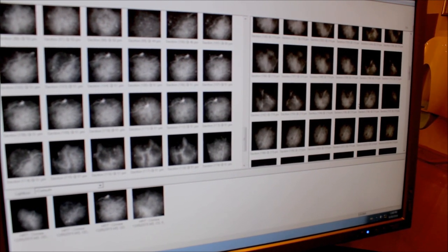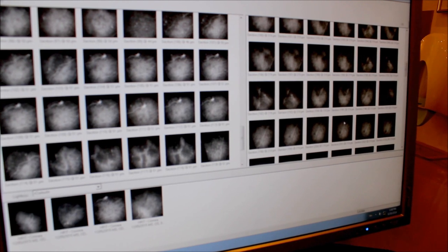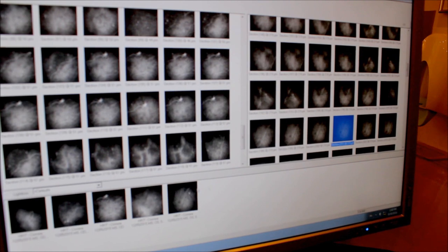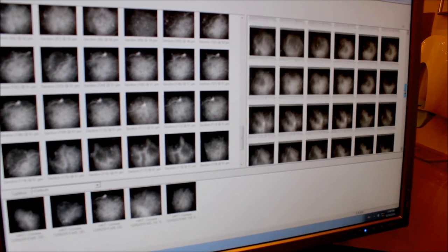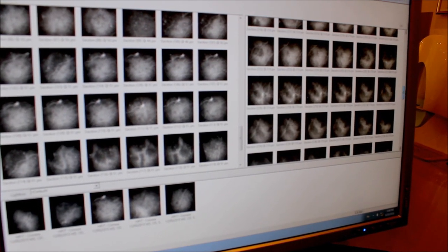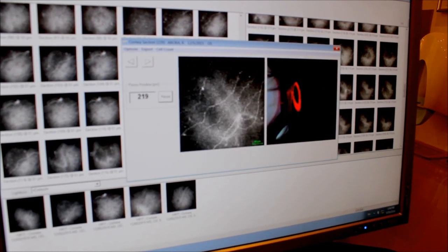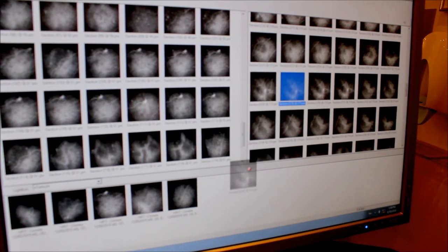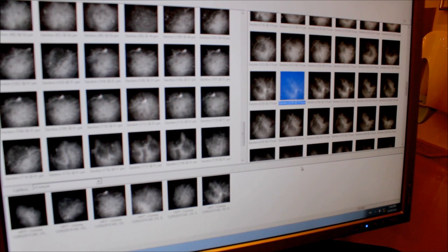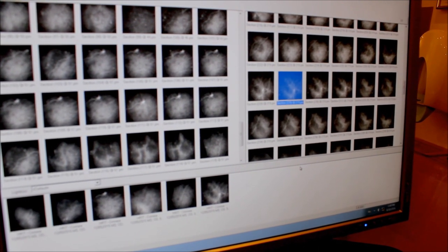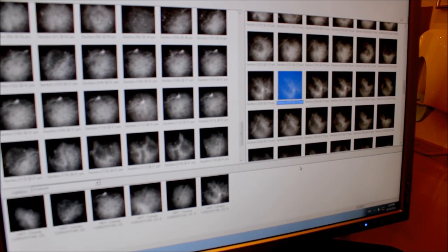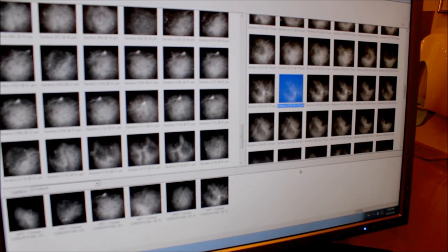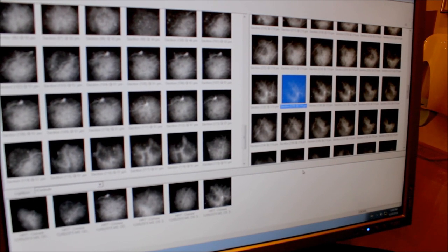Since the image with the two nerves is repeated so many times, I'm going to choose one of these images as my average, my middle value. And then I'm going to choose one of these images which contains about four nerves, or maybe five, as my maximum. In this way, we have created a good range of the density of the nerves that we see in this patient. And now we're ready to analyze and generate the results, and compare to our controls database and see whether this patient has got neuropathy or not.